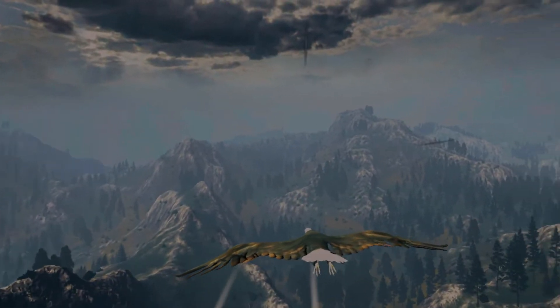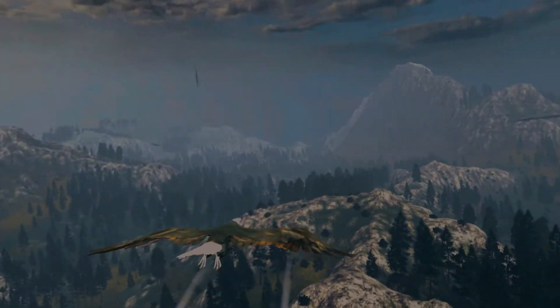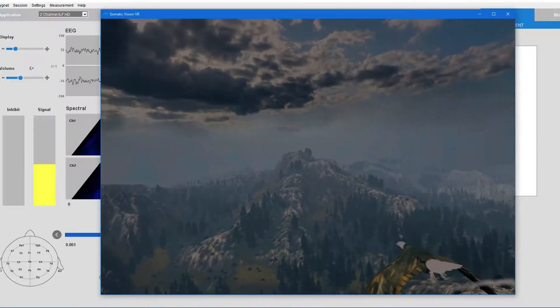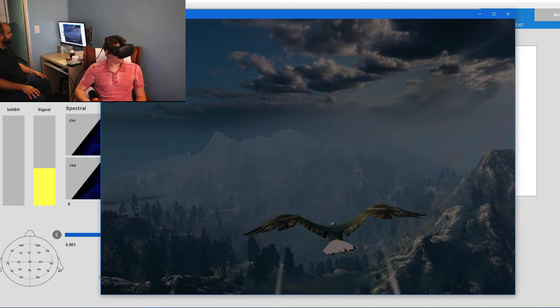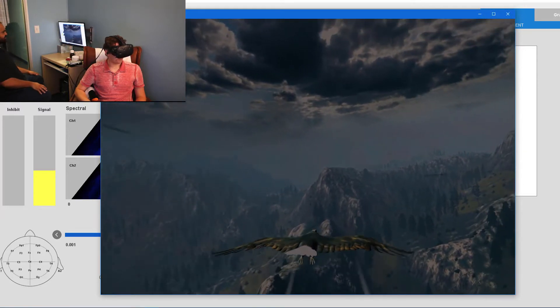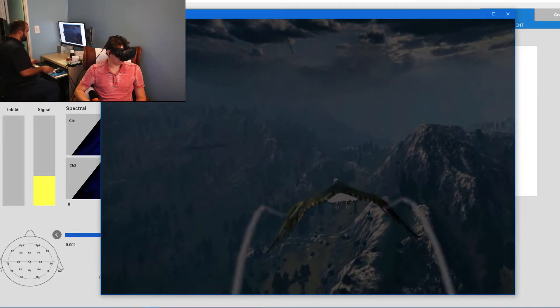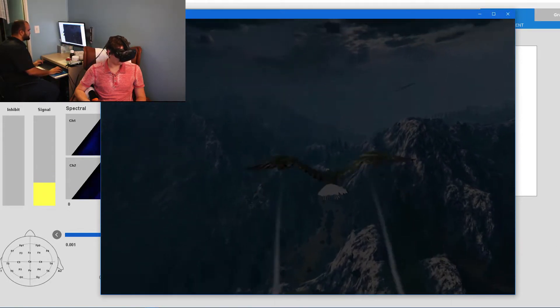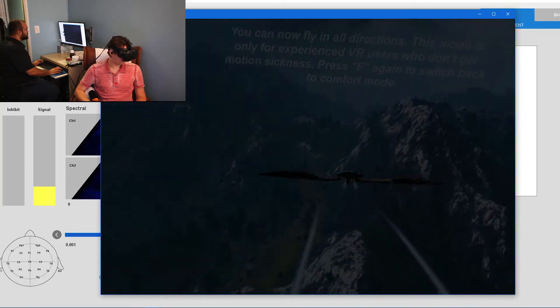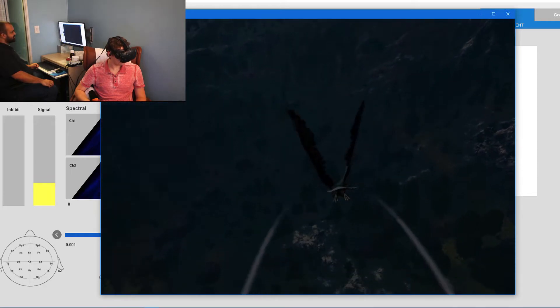Here they go with the beautiful eagle game. So you fly this eagle over the landscape, and you look around as you fly. He's pressing the F key on the keyboard, and that puts you in free flight. For those who are a little more sensitive in the stomach, free flight might not be for them. But if it doesn't make you nauseous, you press F, it puts you in free flight, and then you can look around, turn, steer, and go anywhere you like.